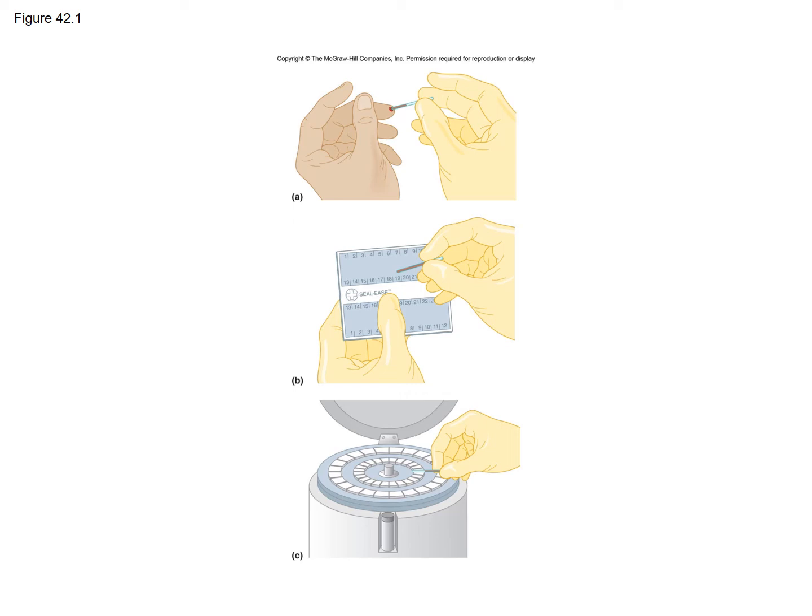Okay, today we will talk about the blood. So when you first go to the doctor, usually he takes the blood sample and puts the blood in a centrifuge, like this machine that you can see right here. And actually, we had this in the lab, but unfortunately, we just meet online.